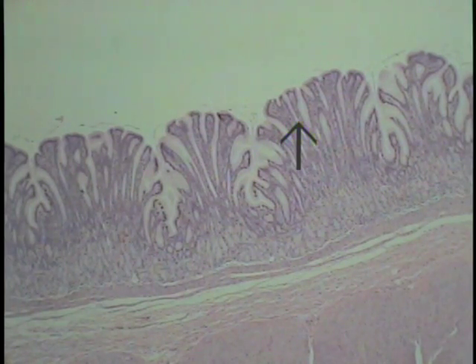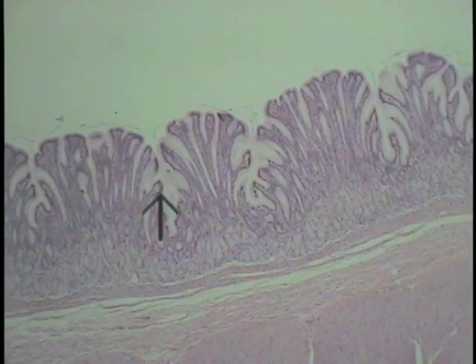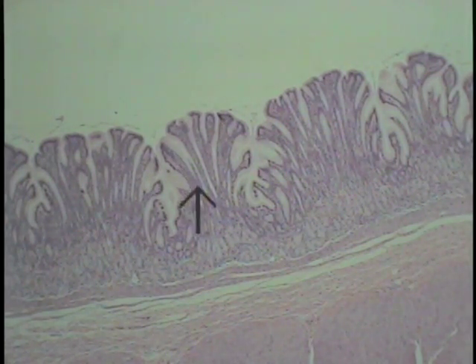This particular field represents a scanning objective view of the pyloric portion of the stomach. You can see these large folds. These correspond to what is seen in the rugae in section, and also shown are the rather elongated gastric pits extending down into the lamina propria.